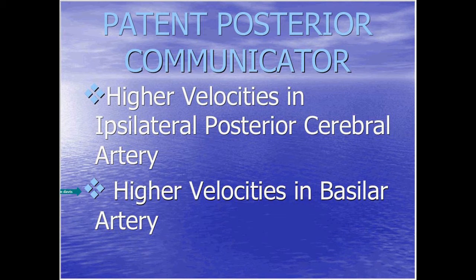And you're going to be a Sherlock Holmes. I mean, let's face it, when you're doing any study, you want to look at the whole ball of wax. We're looking at the body as a system. So what do the carotids look like? If the carotids are clean and I have high flows in the basilar, you're certainly not going to say, well, that's collateral, because it's not. Their carotids are clean. They're open. So you have to remember, if you have high flows or flow reversals in these other vessels, you've got to look at the carotid artery. Think about, well, what does it look like downstairs? I know what the upstairs looks like, but how healthy do I look downstairs?